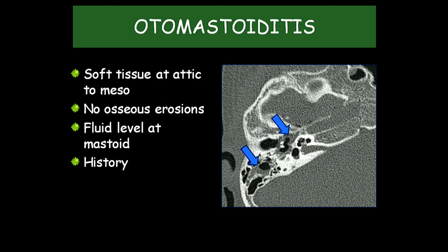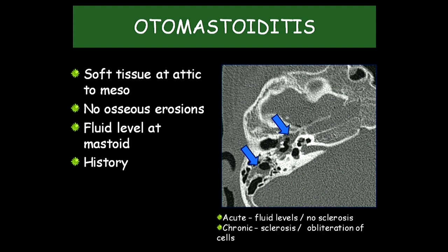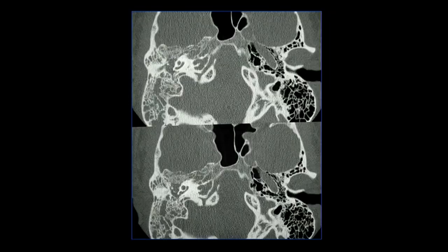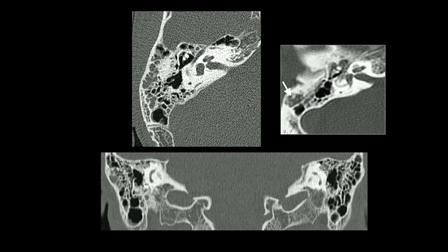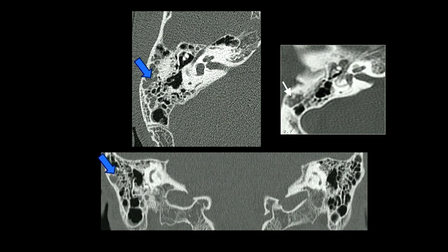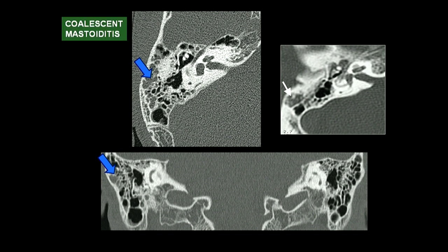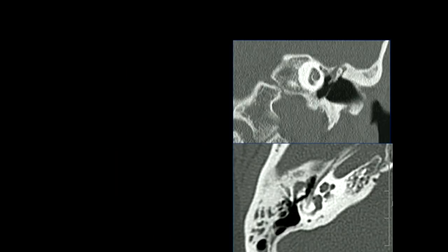This is very straightforward: as long as the ossicular chain is intact and there is no scutum erosion, it is reasonable to suggest otomastoiditis. In acute cases you tend to have fluid levels with no sclerosis, but in chronic cases you start getting sclerosis and obliteration of cells. With repeated inflammation, soft tissue fills the mastoid cells, you start getting sclerosis, and then large cell formation as walls break down due to pressure and enzymes — gradually becoming coalescent mastoiditis.